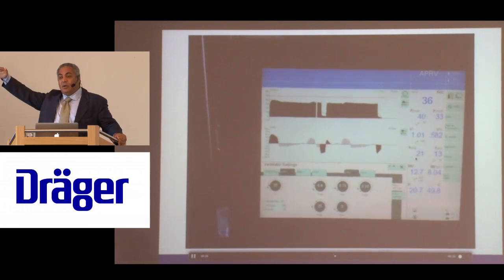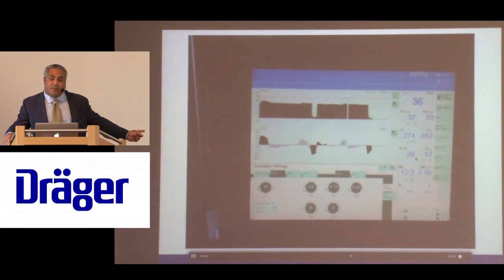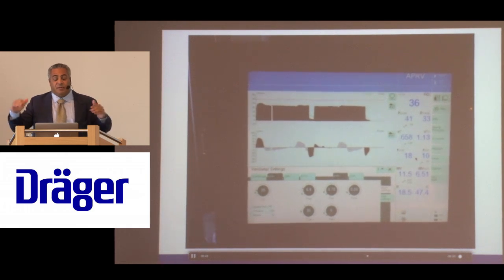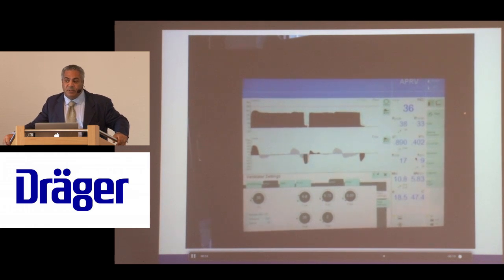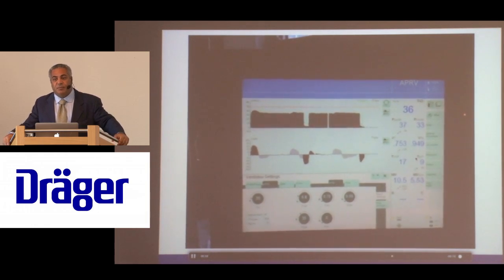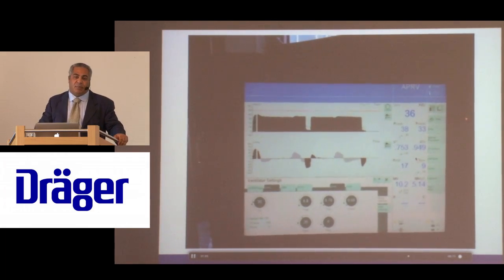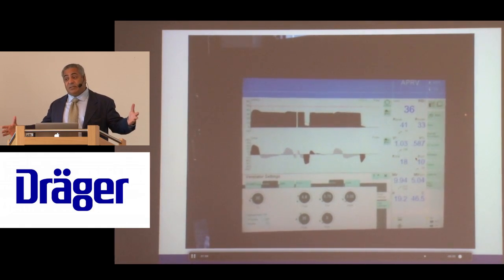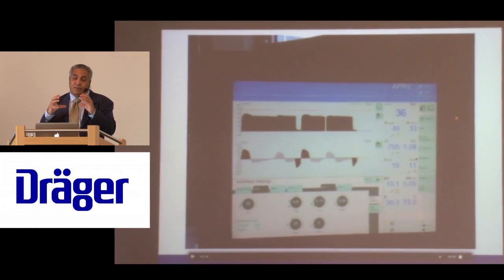You would be on the flat part of the pressure volume curve. So I can tell you this patient is not on that flat part of the pressure volume curve. There's no way the patient can breathe comfortably with that tidal volume being on the flat part. Of course, we don't like being on the low part of the pressure volume curve either, because it's very difficult for us to breathe. So I know this patient's on the steep part of the pressure volume curve because they're comfortably breathing. Now this patient is more than 200 kilograms. He has a gastric bypass that went very wrong, and he has an open abdomen, and he's very edematous, and his chest wall and abdomen are squashing his lungs. And 35 centimeters is just restoring his lung volume.